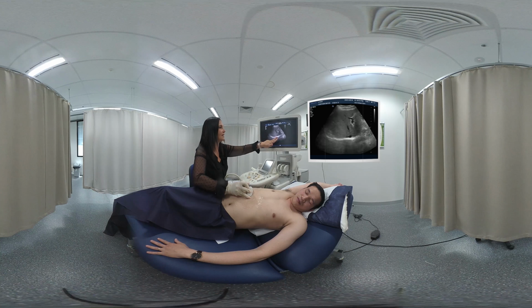Breathe away. Okay, so now we're going to start our transverse scanning plane, and what we're seeing here is the portal vein. So I'll show you that so that you know round about where to find it. Big breath in there for me, patient, that's it. So this echogenic walled vessel is our portal vein, so we're seeing it there. Breathe away. So it runs in a parallel tram track fashion, and this is the right portal vein traversing into the liver.